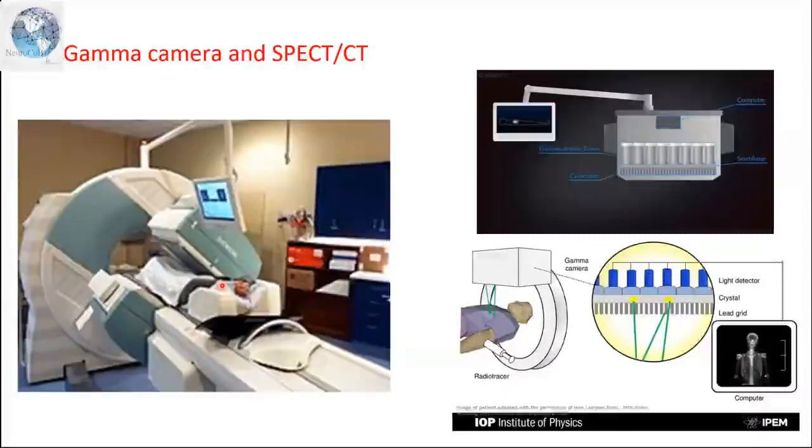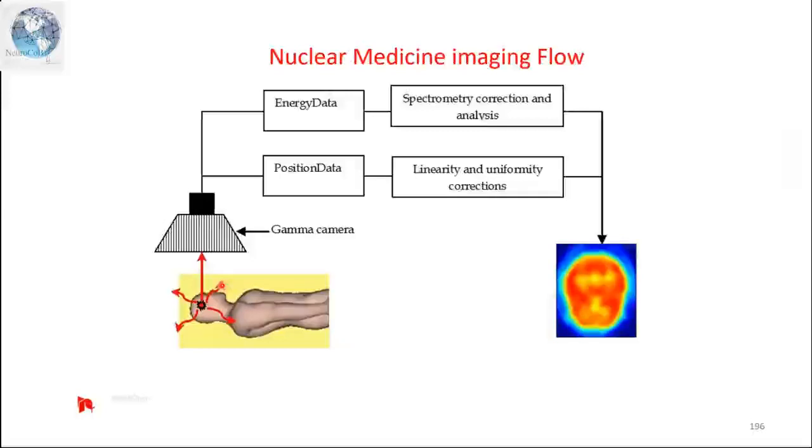So machine yang sama boleh buat imaging nuklear dengan anatomy, CT scan. So kamu boleh dapat satu gambar fusion, tahu fungsi dan tahu juga anatomical localization. Okay, that is SPECT-CT. And then banyak nuclear data ni boleh diguna kebanyakannya untuk cancer detection, but also for neurodegenerative, epilepsy, brain tumors, stroke, semua boleh digunakan bergantung pada what is the radiopharmaceutical.